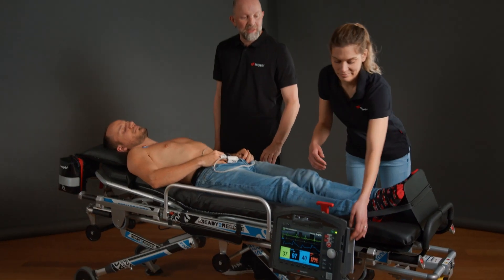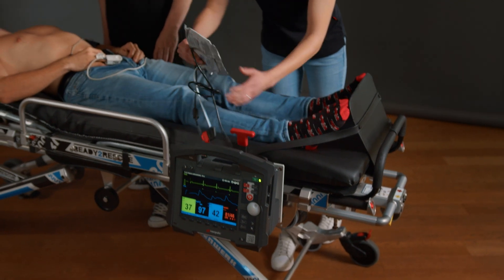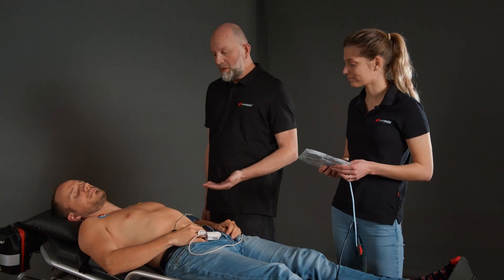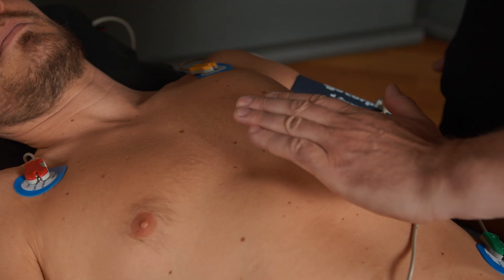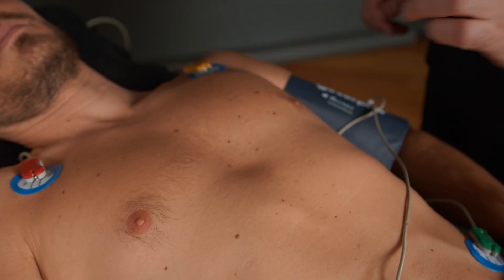Would you please get out the therapy electrodes? We have opted for the adhesive anterior-posterior variant. As a reference, we can orient ourselves on the lower third of the sternum at the level of the 5th intercostal space, slightly offset to the left.